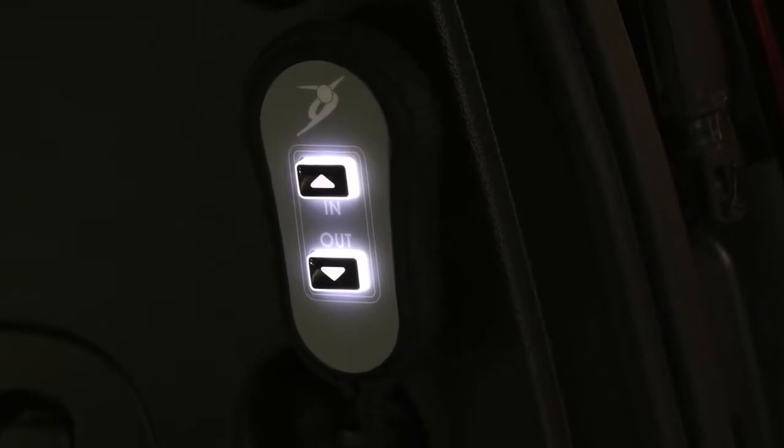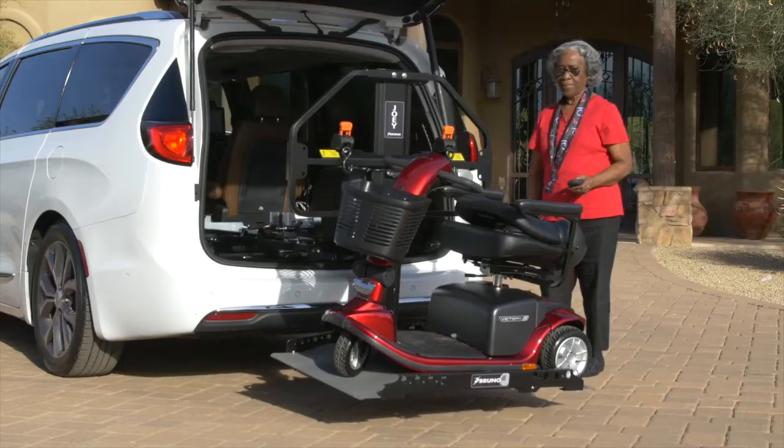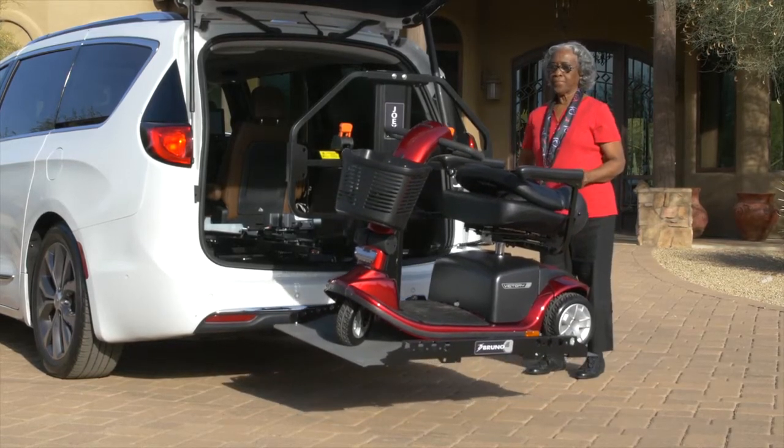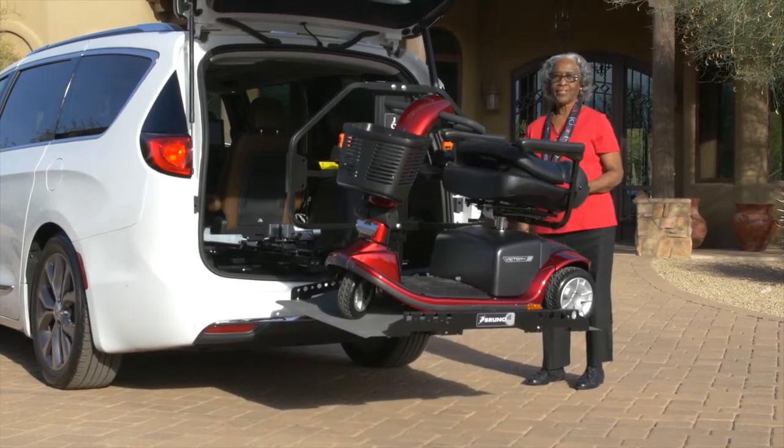A backlit hand control and illuminated platform makes it easy to load and unload at night. The compact Joey allows second-row seating to be retained in most vehicles, so you can take your mobility device and passengers to your destination.